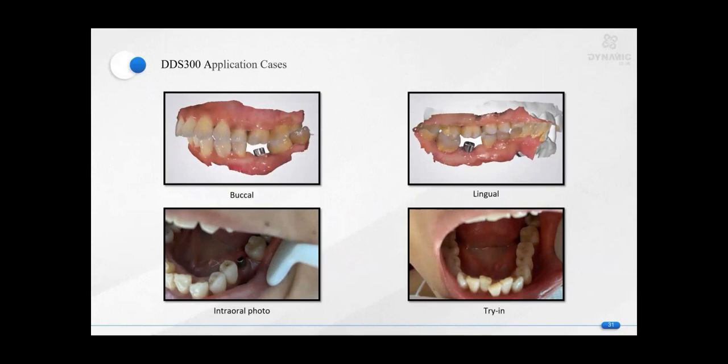Such as the small blood vessels on the soft tissue, you can see from the first image, the blood vessels are very clear, and the patient's teeth, and the presence of a large number of calculus.